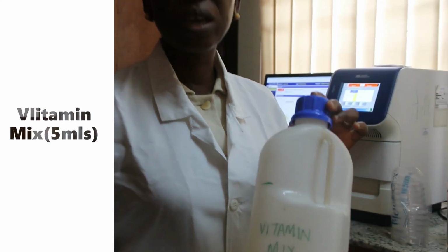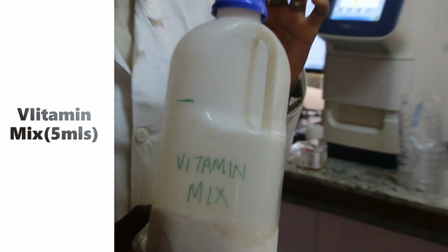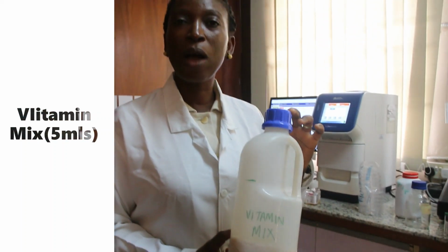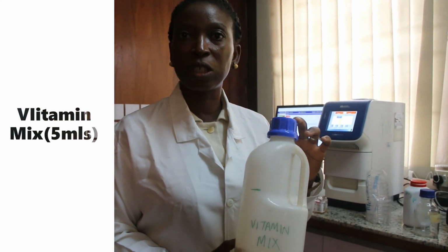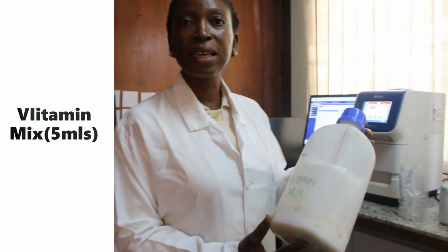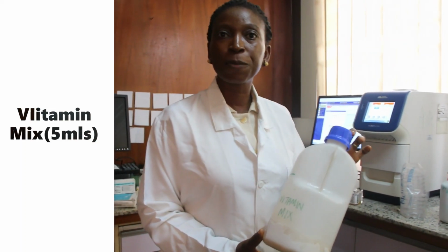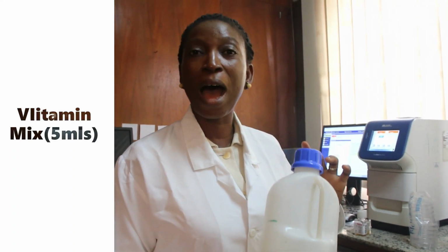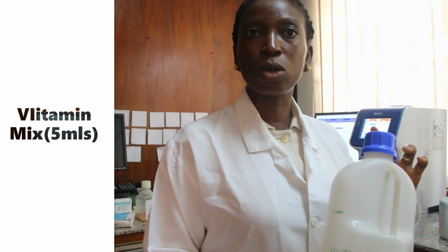This vitamin mix can be purchased commercially. For example, an Isovitalex product contains NAD, nicotinamide adenine dinucleotide, vitamins, ferric iron, and other amino acids and factors.